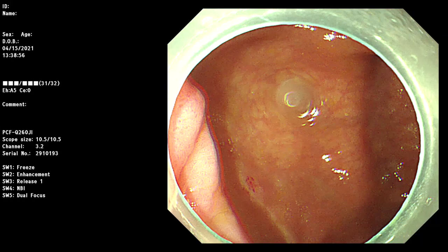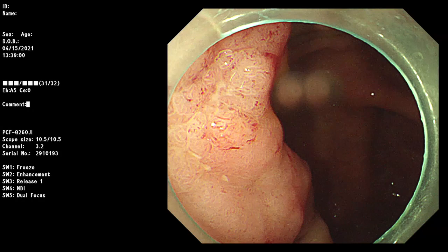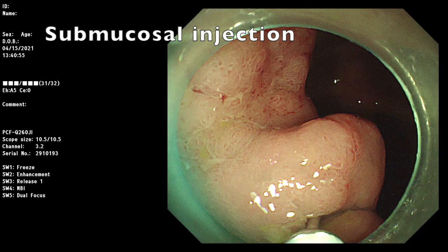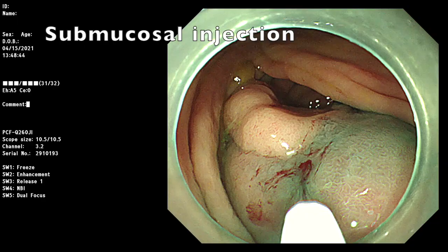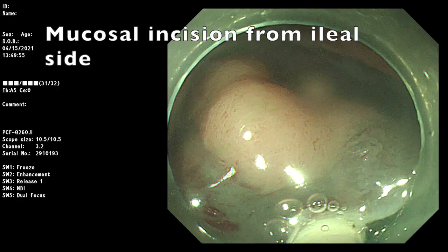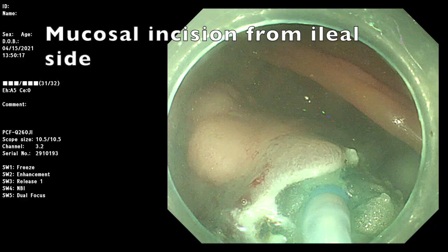Here we can see the video. It is very easy to perform submucosal injection over the ileocecal side, and we should not inject too much fluid. Once the submucosal layer is elevated, the trimming and dissection can be done safely.